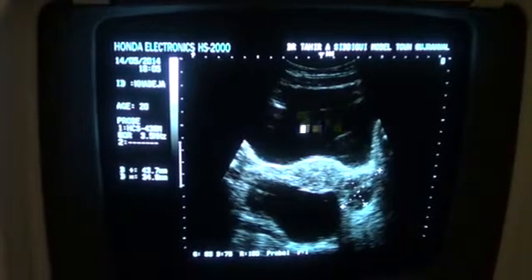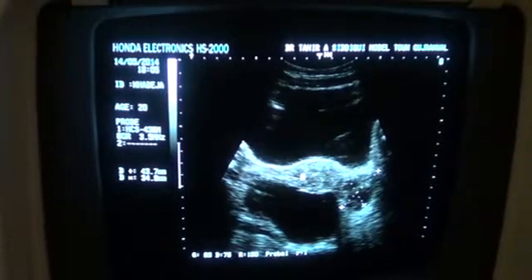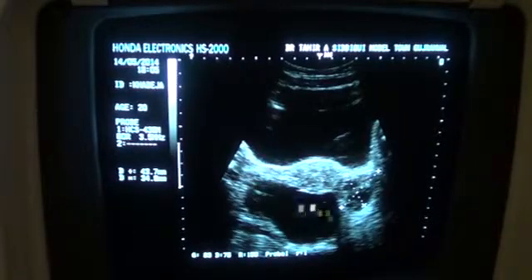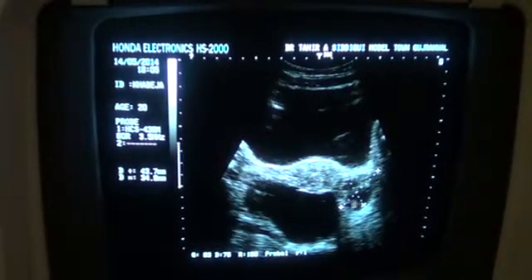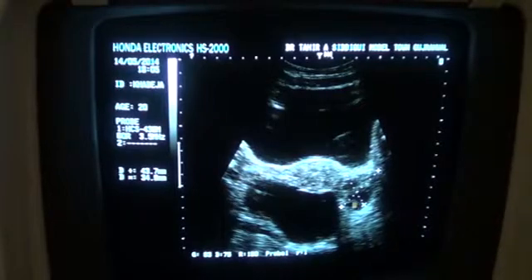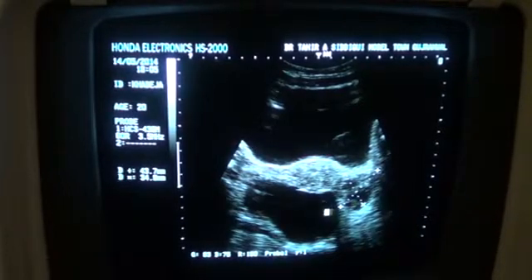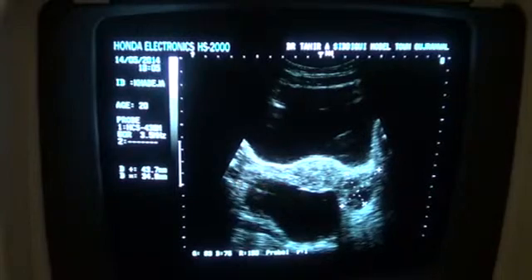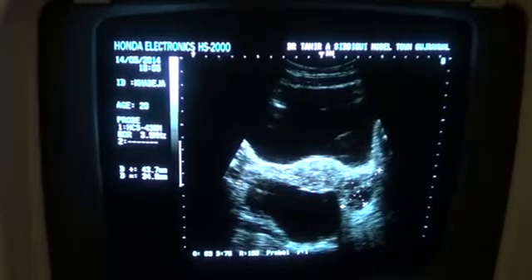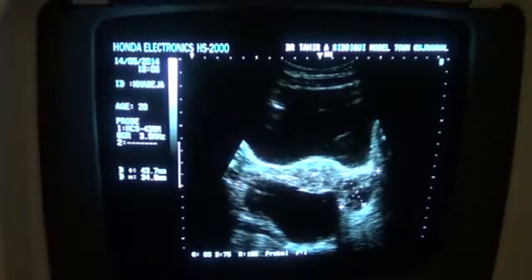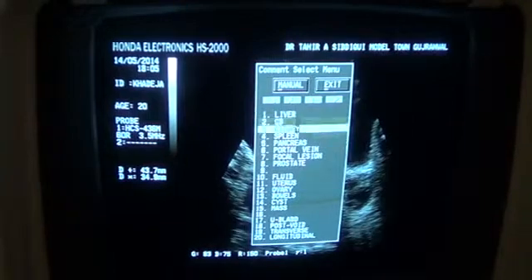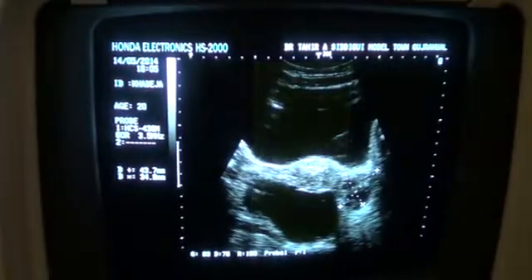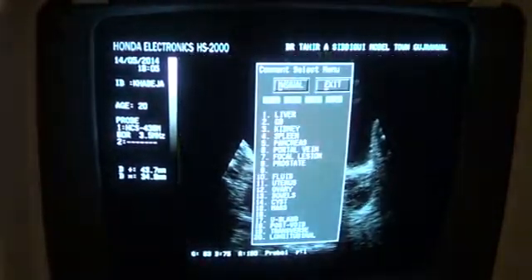This is the urinary bladder. This is the uterus in transverse section. And this is the cystic area, presently seen posterior to the uterus and then extending into the right adnexa. The uterus is in transverse section.